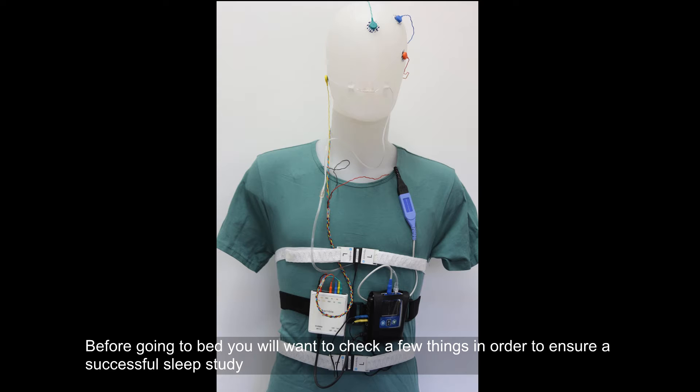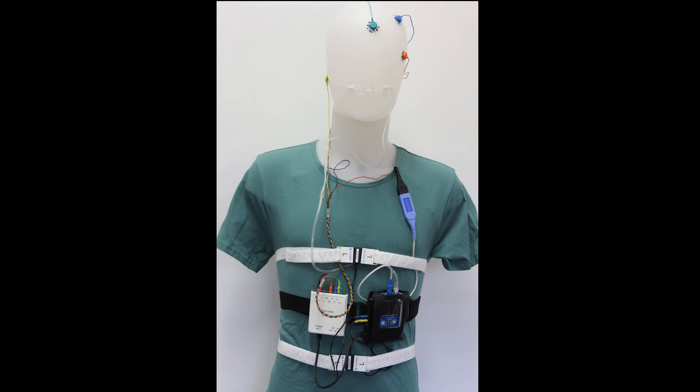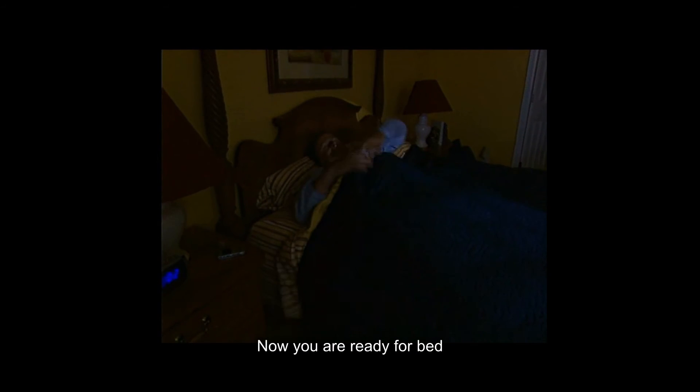Before going to bed you will want to check a few things in order to ensure a successful sleep study. Please check that the sensors are placed correctly on your body and check that the sensors are firmly connected to the Ambleta device. Now you are ready for bed.